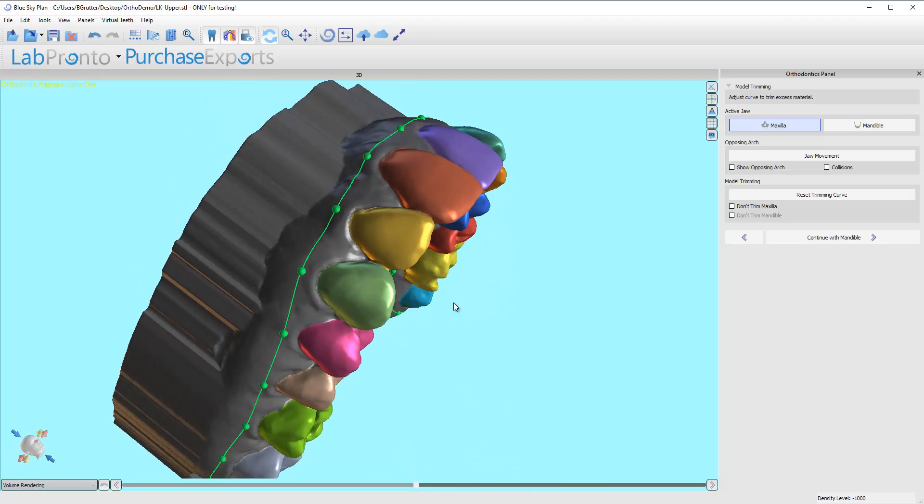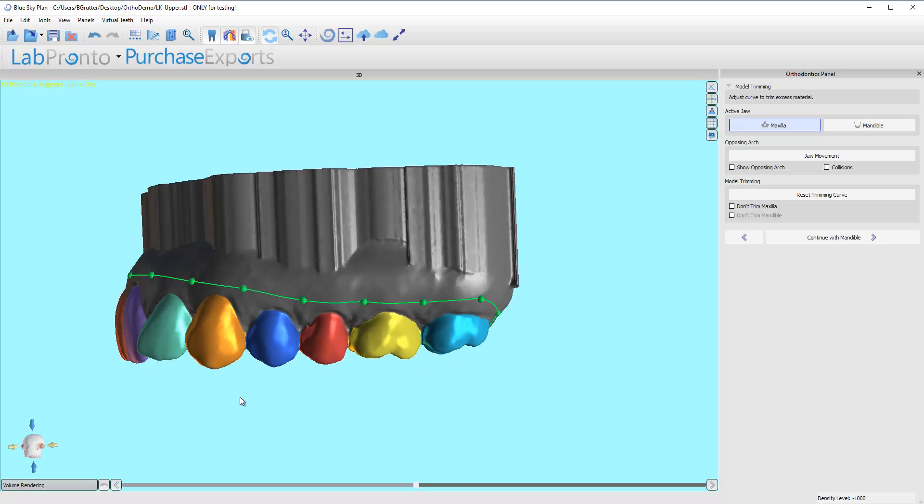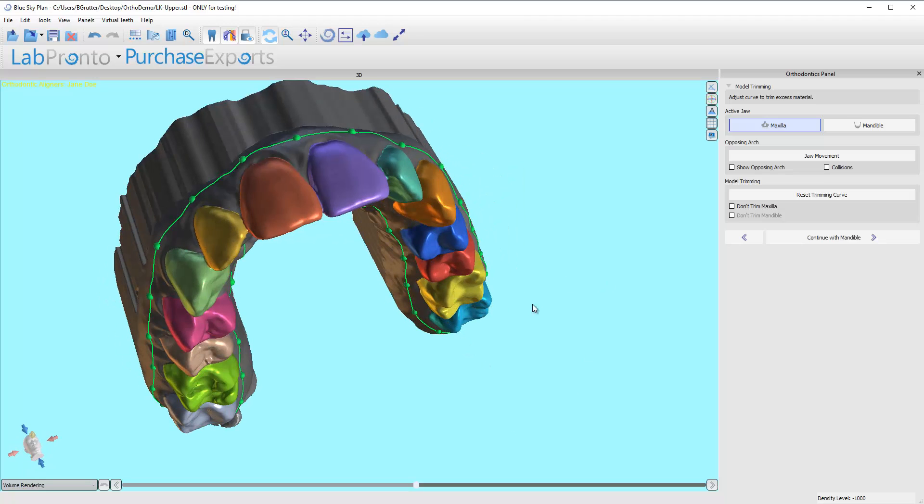Make sure that on the facial side the line doesn't inadvertently come up over the top of a tooth — it can happen at times. So just scope it out, take a look, and move on.